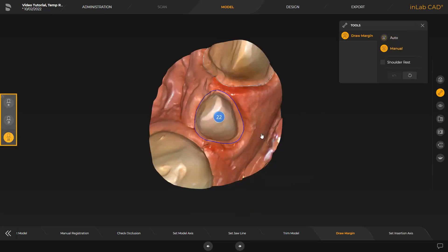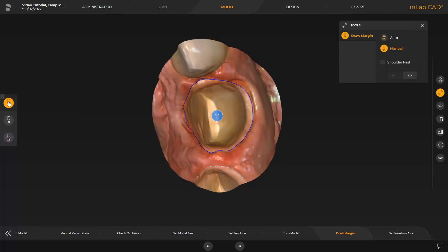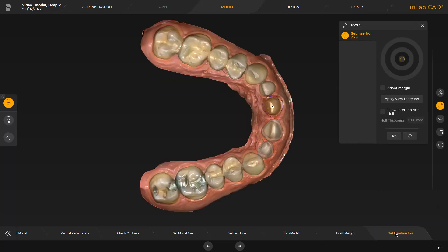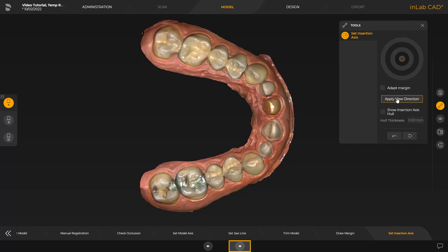At the left edge of the screen, you can navigate between the individual tooth positions. Lastly, we set the insertion axis in this phase. This is also automatically suggested by the software. Modifications can be performed with the arrow above the preparation. Alternatively, you can use the Apply View Direction option to set the insertion axis. For the other two tooth positions, we accept the suggested insertion axis and go to the next phase, the design phase.